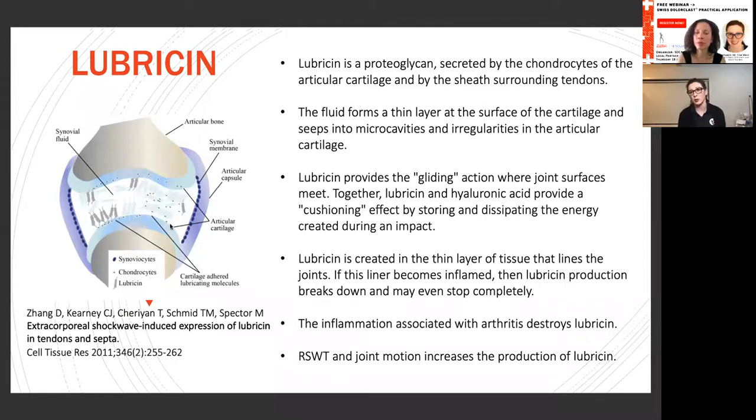And if we're talking about a tendon, when we have a chronically inflamed tendon, very dry, they get very thick, they get very brittle, and they rub on the sheath that surrounds the tendon. So if you can get that tendon sheath to secrete more lubricant, all of a sudden that tendon glides in and out of the sheath much better. So both for tendon problems and for joint problems, this is probably the biggest draw card.